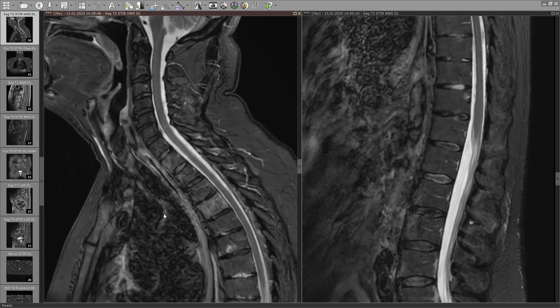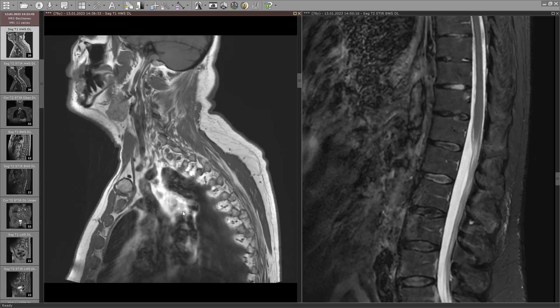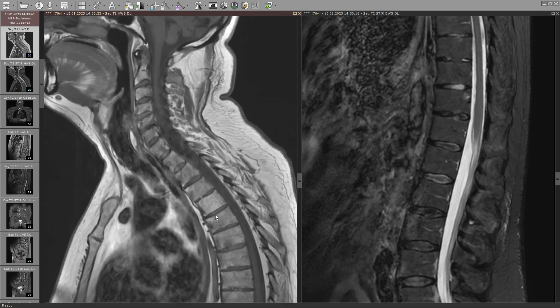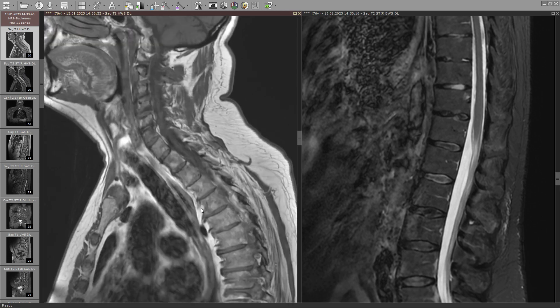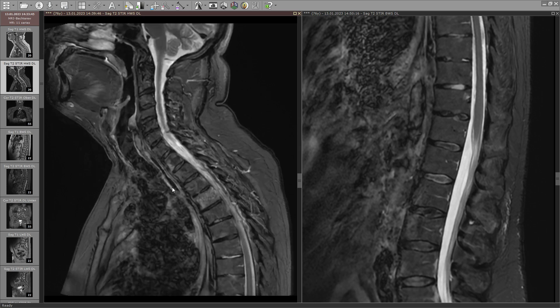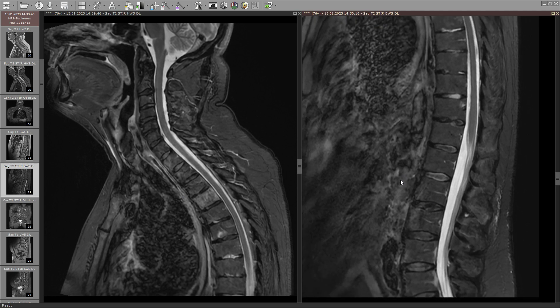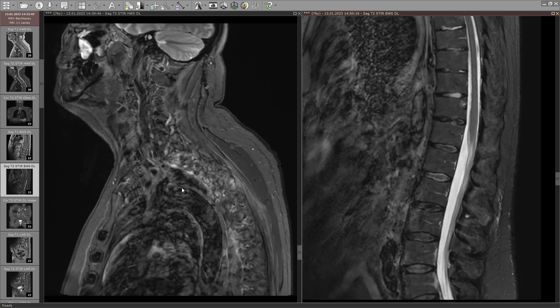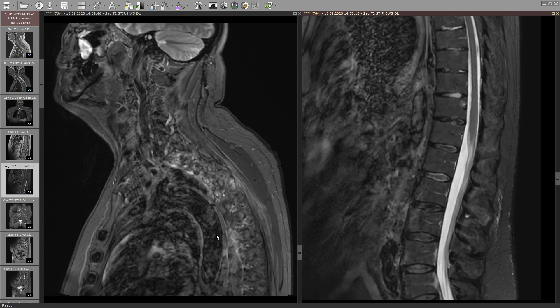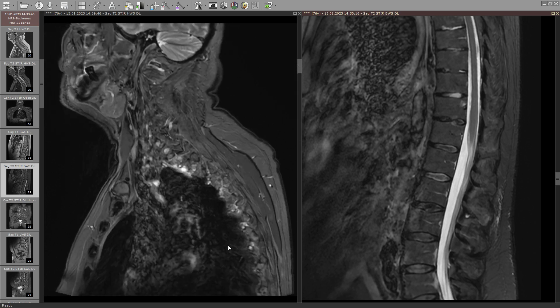This is just a hemangioma that we can confirm on a T1 here — you can see it here in the vertebral body. Whenever you have these spine MRIs for inflammatory or suspected axial spondyloarthritis, it's always key to first scan far enough laterally and then also look at the costotransversal and/or costovertebral joints.